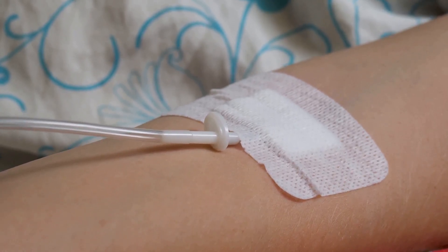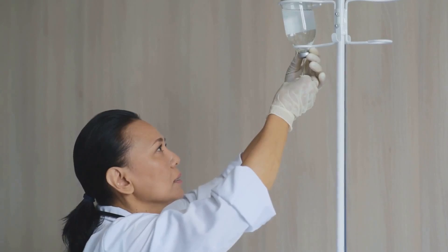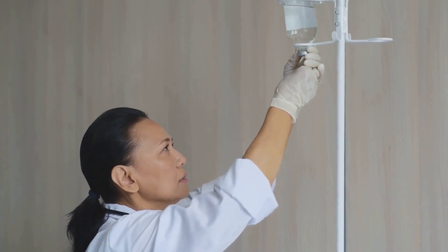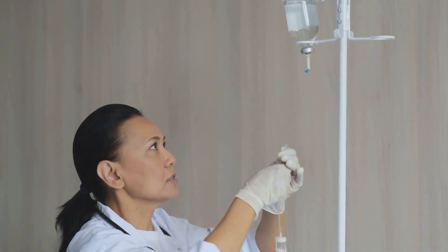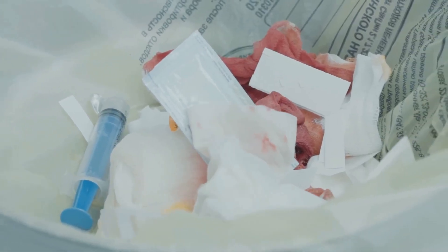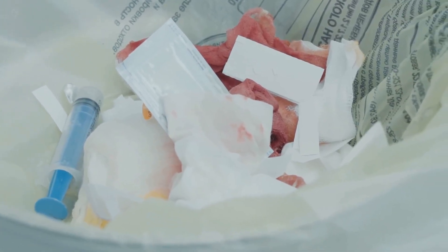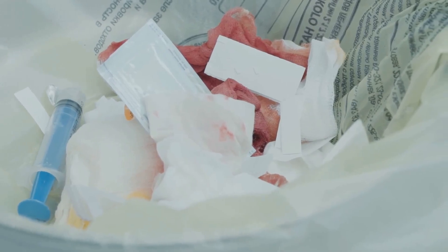Now, secure the cannula. Advance the cannula slightly, then hold it steady while withdrawing the needle. Take care not to move the cannula too much to avoid vein injury. Dispose of the needle safely in the sharps container. Safety is always a top priority for both you and your patient.